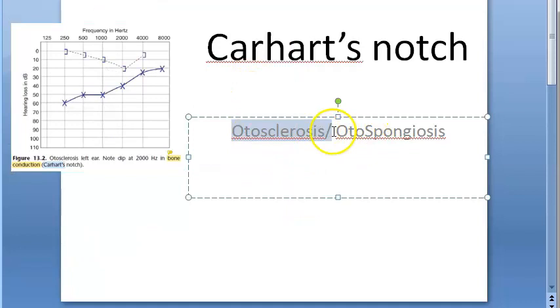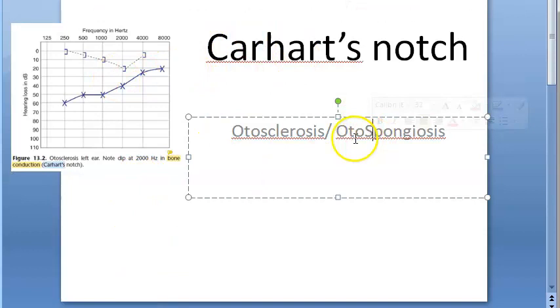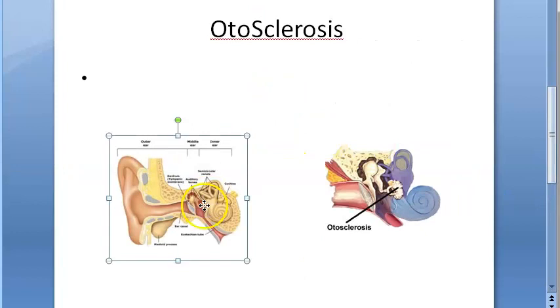This is pure tone audiometry. In otosclerosis or otospongiosis, you see this notch. Where will you see it in the audiogram? In otosclerosis or otospongiosis — both terms are the same. Now, what exactly is this problem, otosclerosis or otospongiosis?